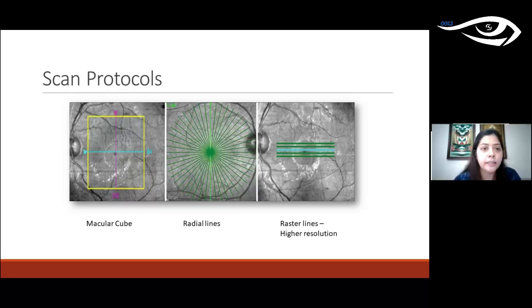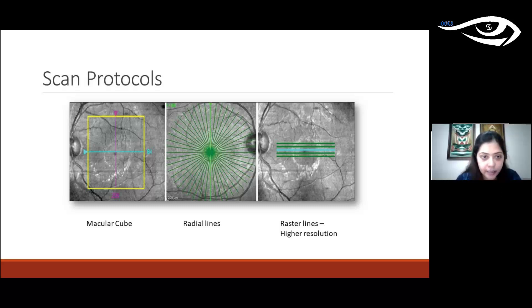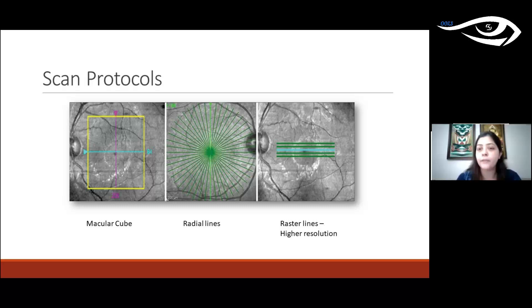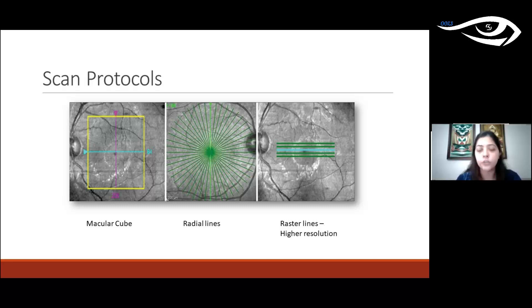Typical scan protocols include the macular cube, which is most commonly used and scans the retina in the area outlined by the cube. There are also radial line scans and raster lines — most machines offer a five or seven line raster. You can center these lines on whichever area you want to image, giving you a higher resolution image of that specific area.